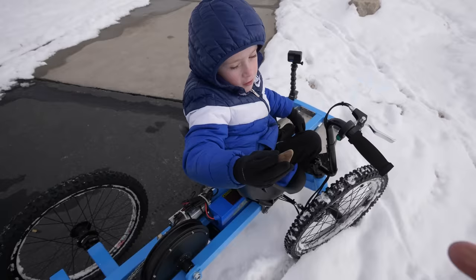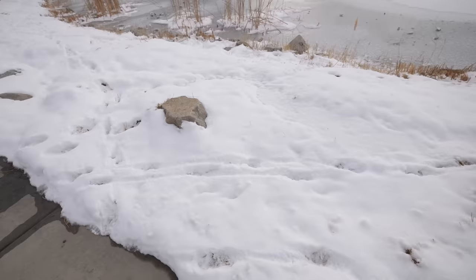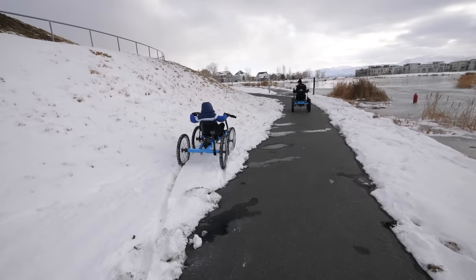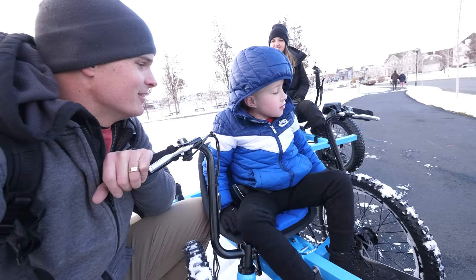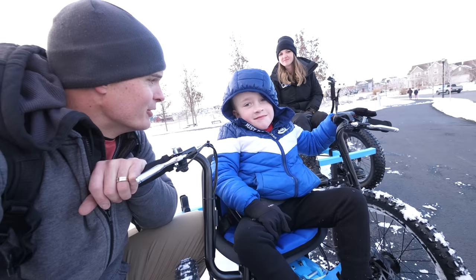Do you think Cole is ready for his surprise? Break and brake! So what do you think, Cole? What do you think of your off-road wheelchair? Pretty good. What would you do if you had one of these? Probably go pretty fast. That's the pretty fast button — I want to push it. Do you want to keep this? Yes. You want to keep it forever? It's yours, you can have it. Thanks!